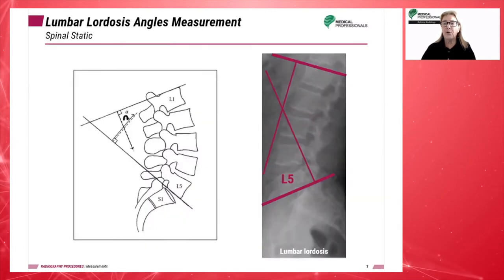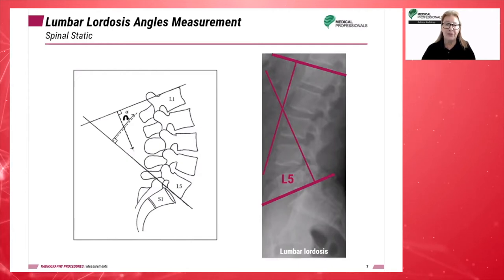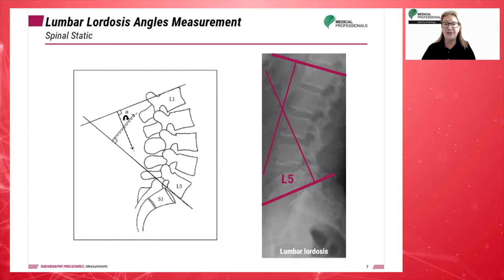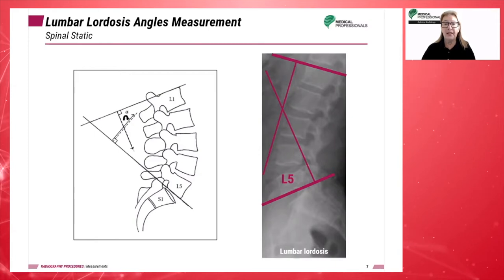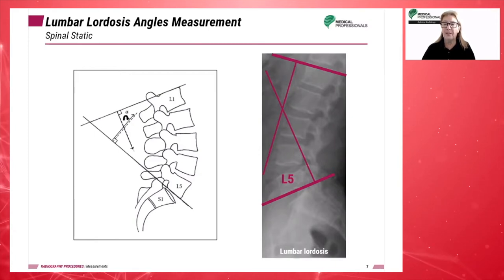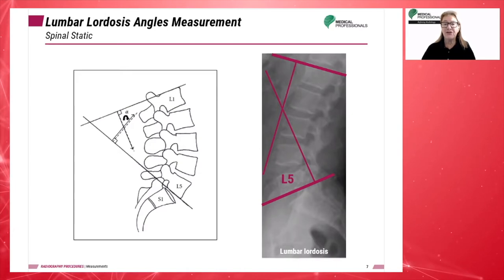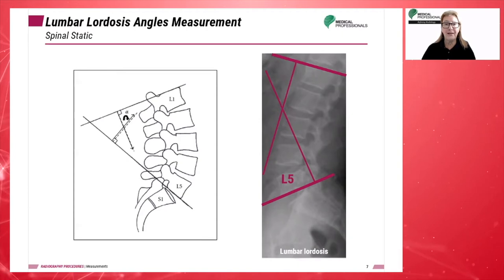Here we can see how the lumbar lordotic angle is measured. Using Cobb's method, tangent lines are drawn along the upper plane of the L1 lumbar vertebra and the upper plane of the S1 sacral vertebra. Then perpendiculars to each of these two lines are added to form the angle.